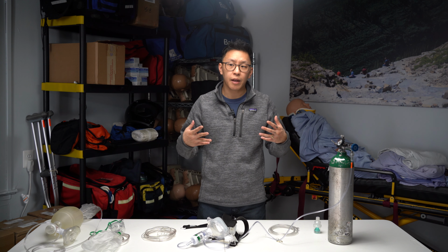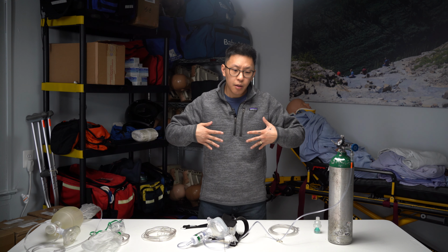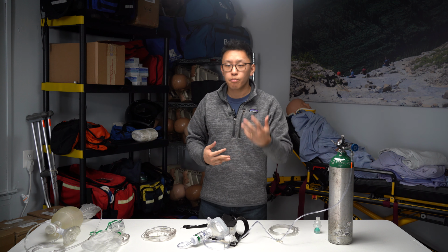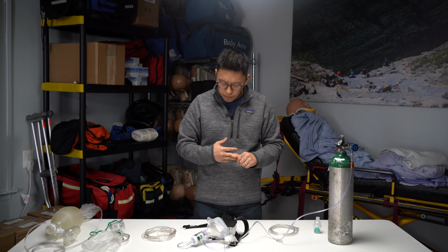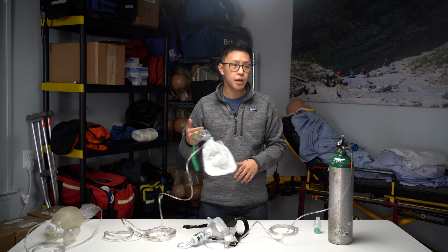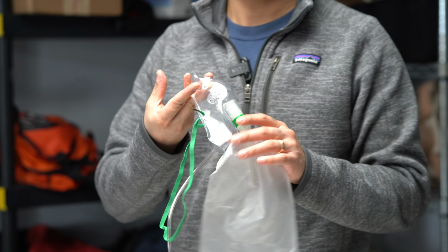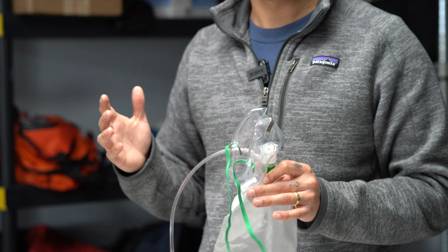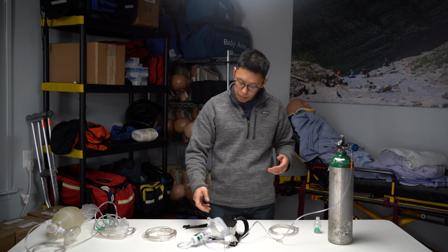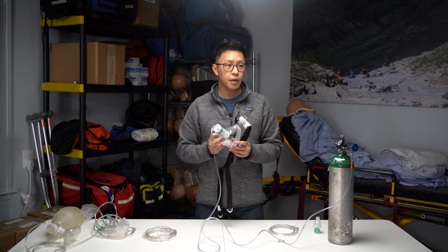If they were to lay supine, that edema would kind of be spread throughout the apex and the base of the lungs, which would make the SOB a little worse. And so we would initially start them off on a non-rebreather at 15 liters per minute. If they weren't feeling better after reassessment, our option, even on the BLS side, is a device called CPAP.